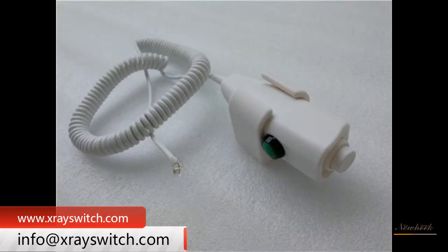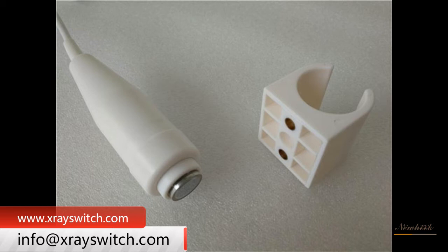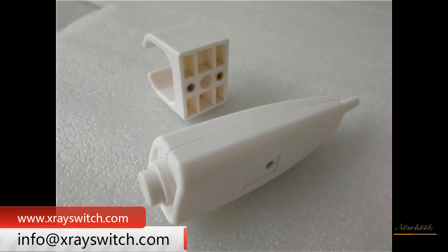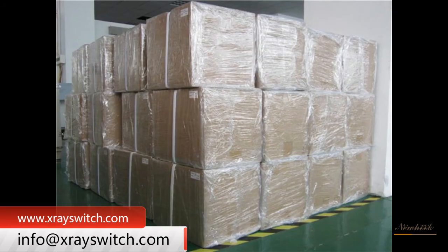New Heek X-ray hand switch is divided into several models and types, including wired and wireless X-ray hand switch. The cable X-ray hand switch is divided into 6 models: L01, L02, L03, L04, L05, and L06. New Heek X-ray hand switch can meet your different purchasing needs.